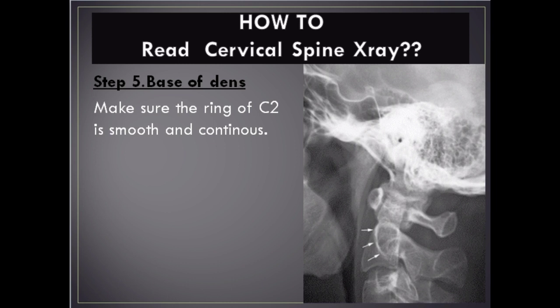Step 5 – Base of Dens: Make sure the ring of C2 is smooth and continuous.